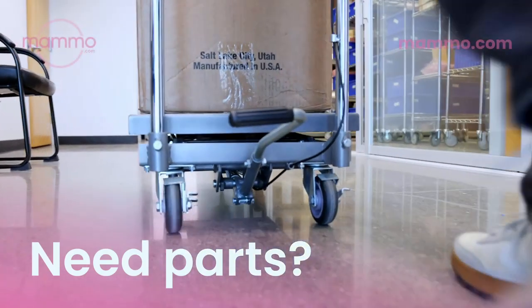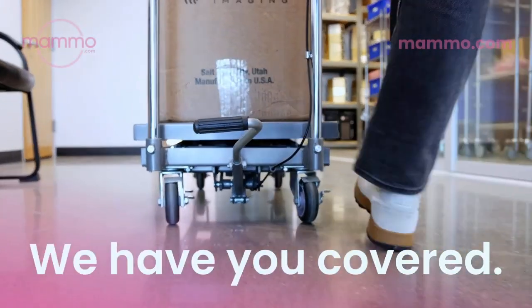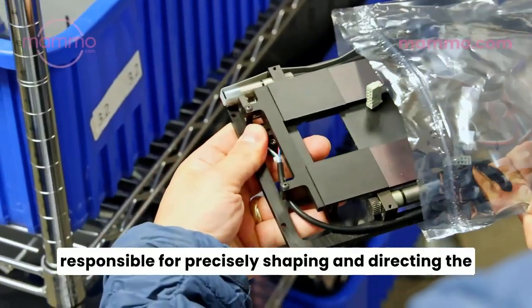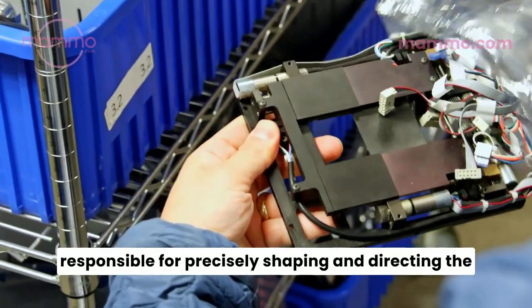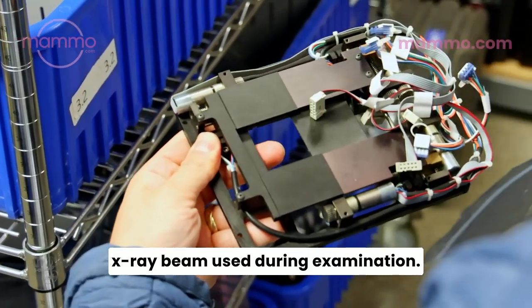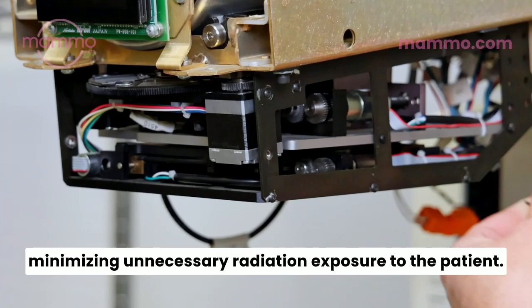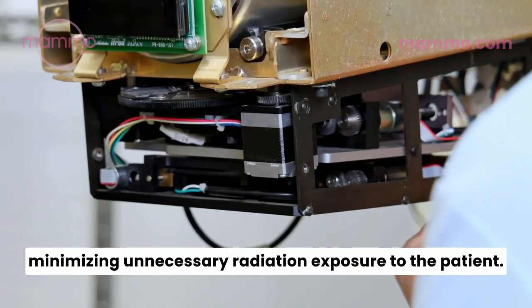In need of parts for your Hologic mammography systems? Mammo.com has you covered. The collimator for the Hologic Dimensions is responsible for precisely shaping and directing the X-ray beam used during examinations. The collimator part enhances image quality while minimizing unnecessary radiation exposure to the patient.